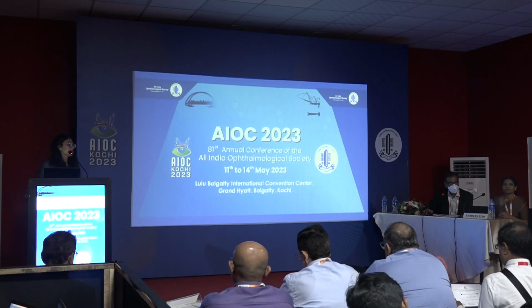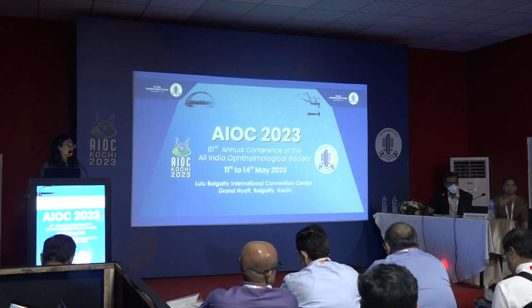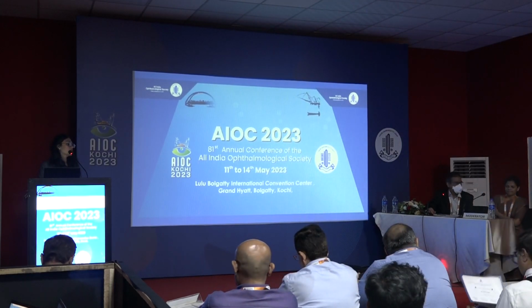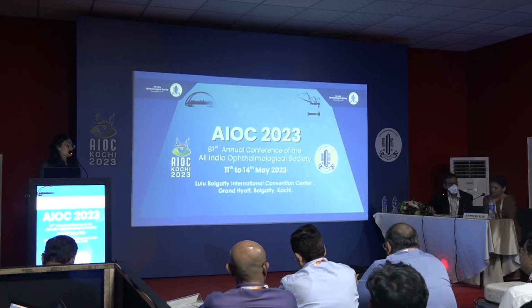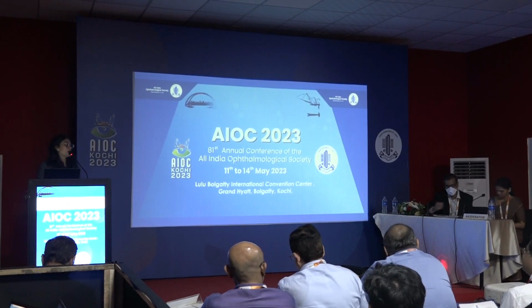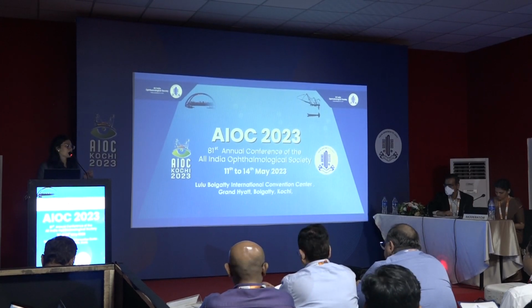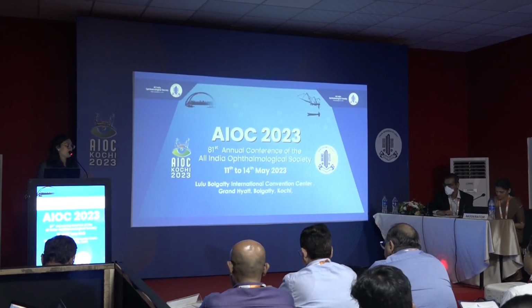Do you have a guard or something to stop it at the subretinal space, or how do you exactly guide? Because these are myopic eyes and the scleral thickness might be different from a regular eye. Correct, sir. So it is mainly when we see the plume of the dye coming into the vitreous space that is when we stop, firstly.